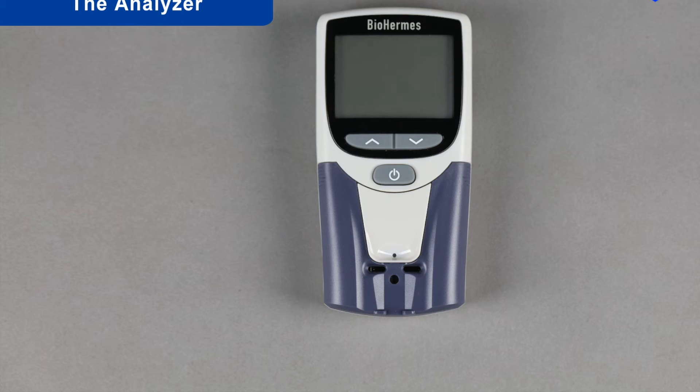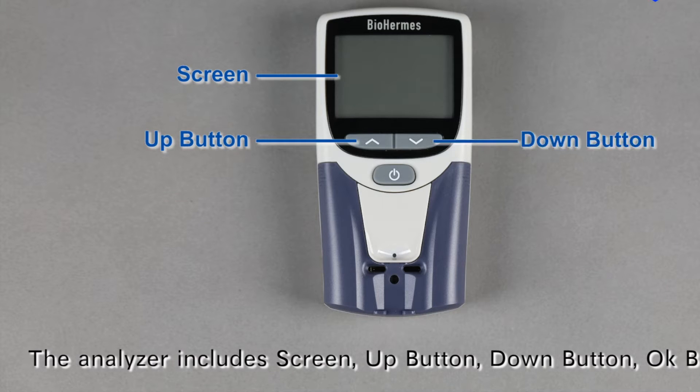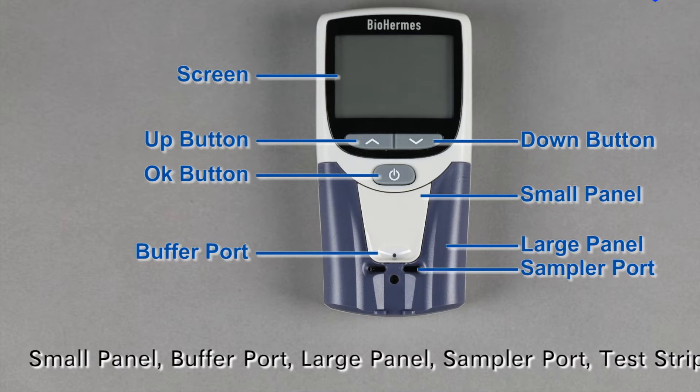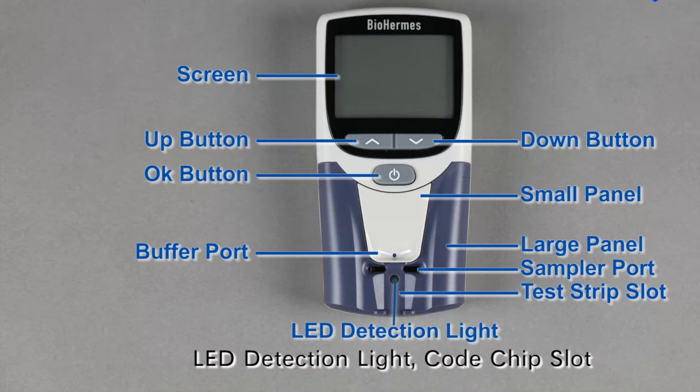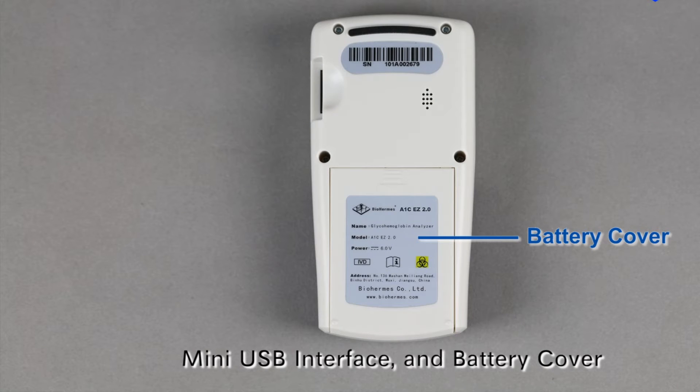The Analyzer. The analyzer includes a screen, up button, down button, OK button, small panel, buffer port, large panel, sampler port, test strip slot, LED detection light, code chip slot, mini USB interface, and battery cover.